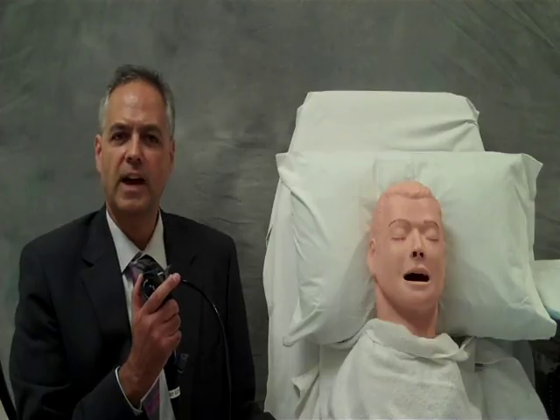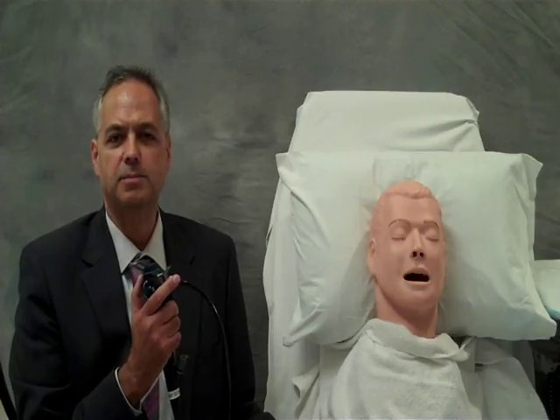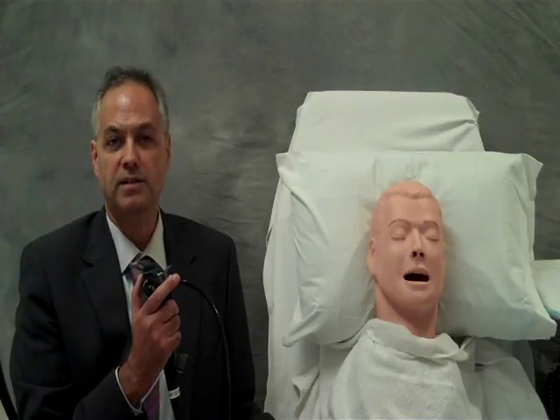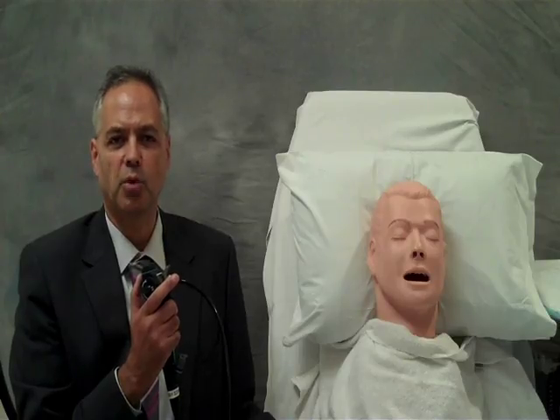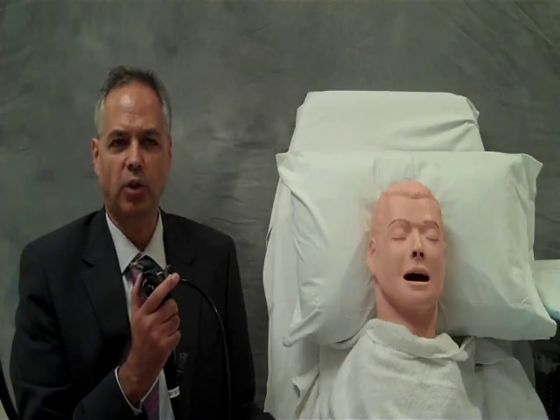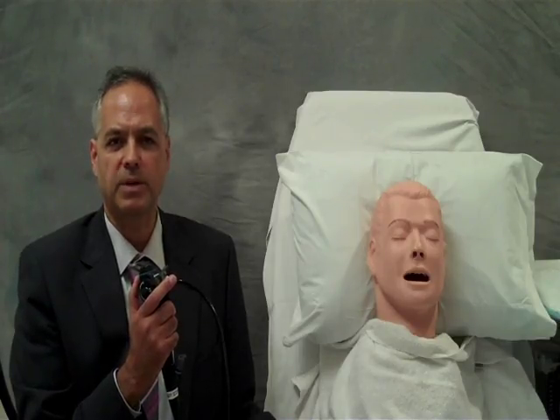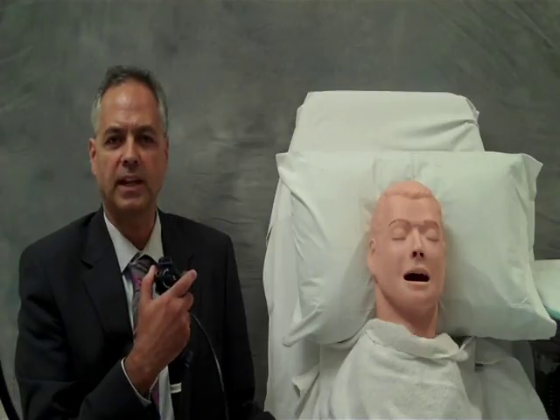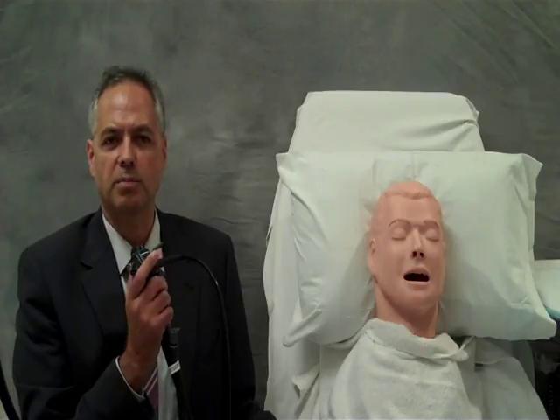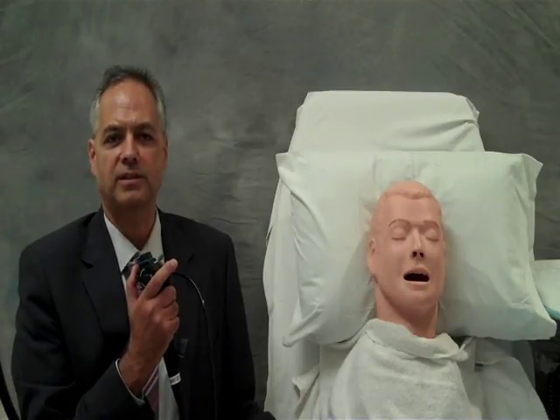This allows us to develop muscle memory and spatial awareness by identifying the appropriate lobar and segmental anatomy and learning to rotate the bronchoscope in an atraumatic fashion.